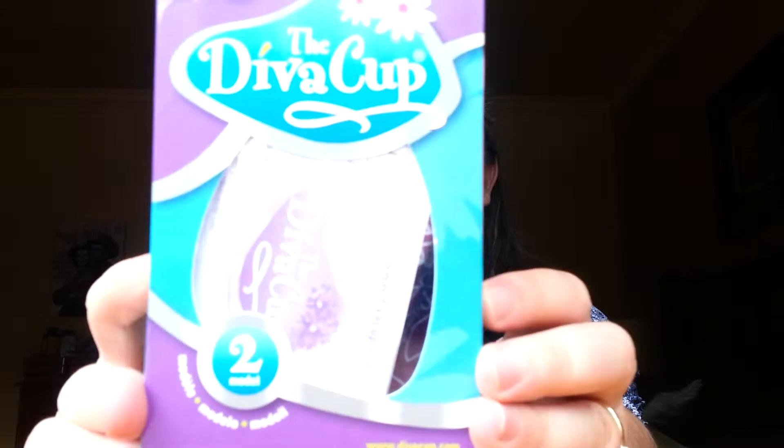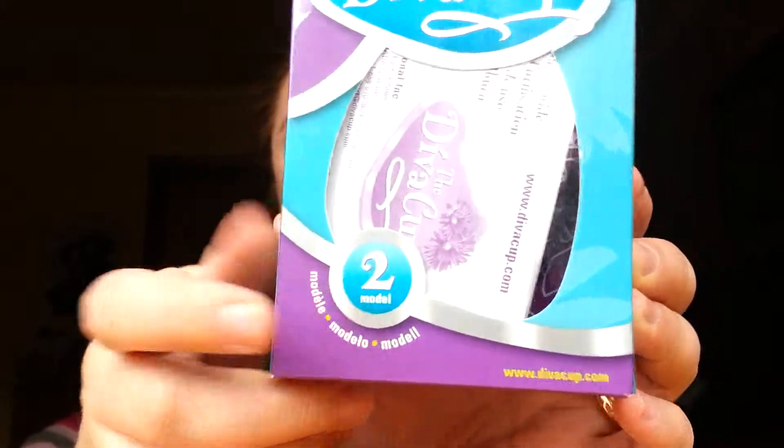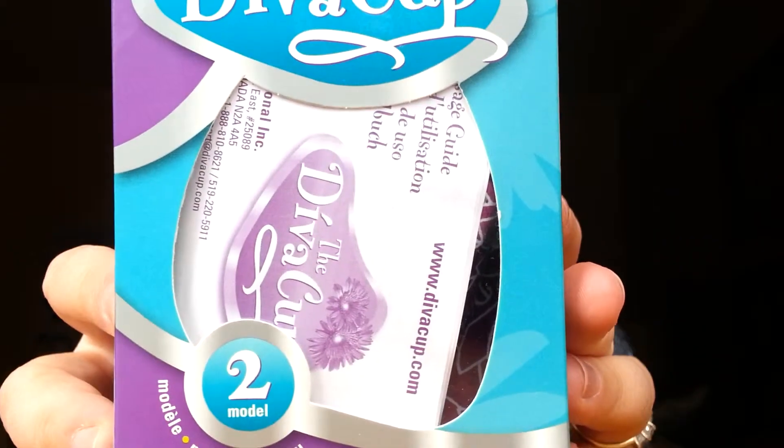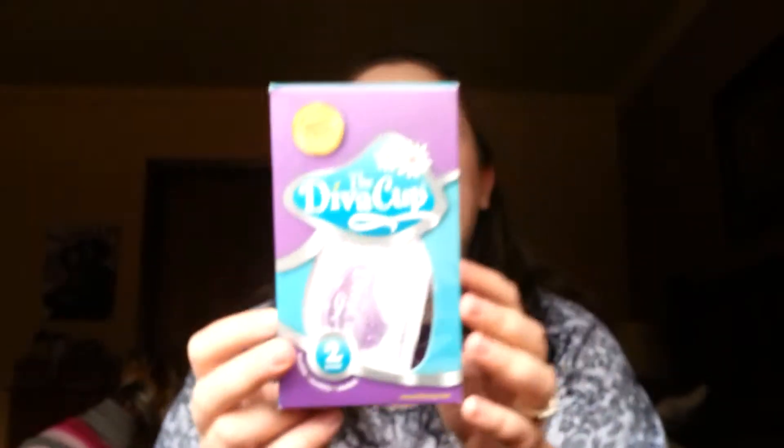Here is the box it came with — I got the Diva Cup Model Number Two. It says it's clean, comfortable, convenient, reusable, economical, and eco-responsible, with proven reliable protection, no leaks, and 100% silicone — no rubber, plastic, or BPA.